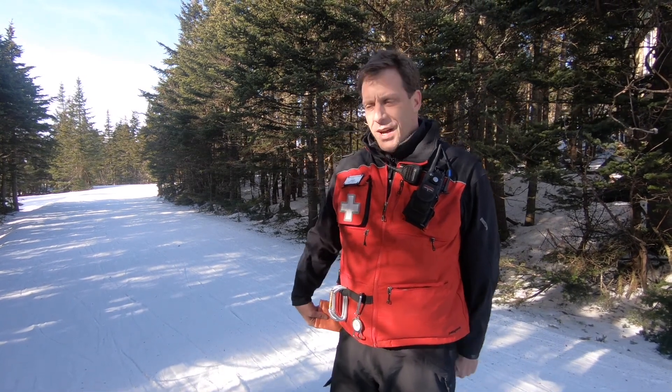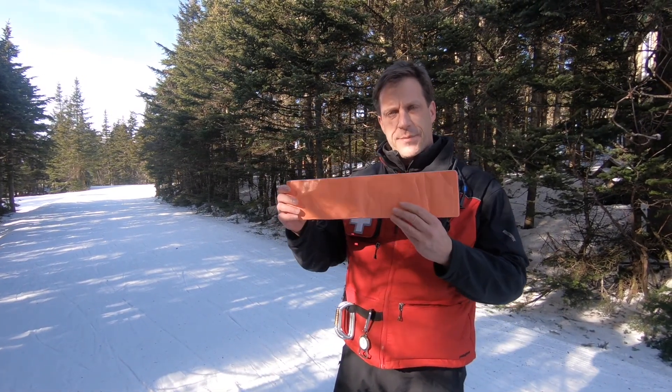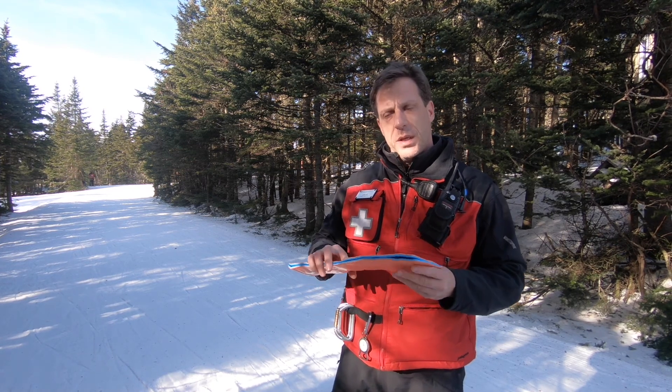Hey, I'm Dave Weiss, the Mount Snow OEC Head Trainer. Today I'm going to talk about our SAM splint and how we use it to immobilize extremities.